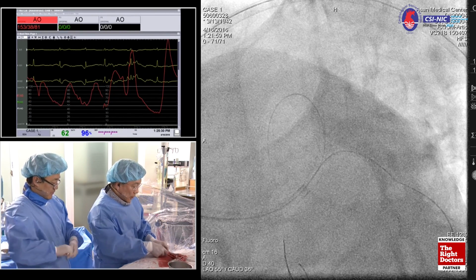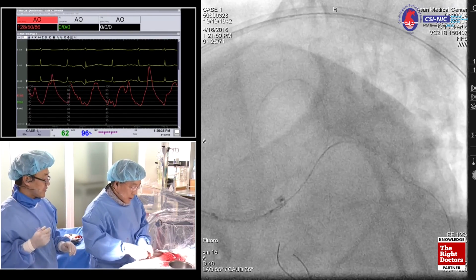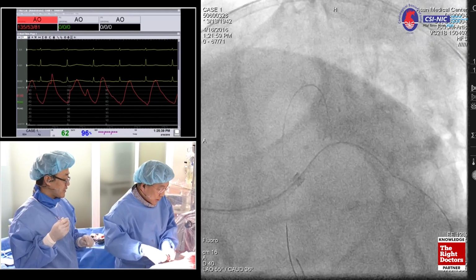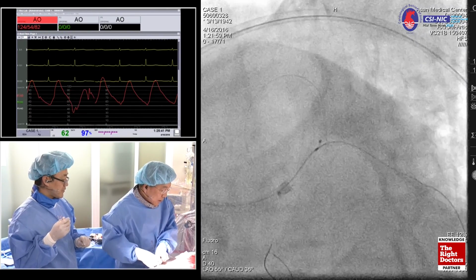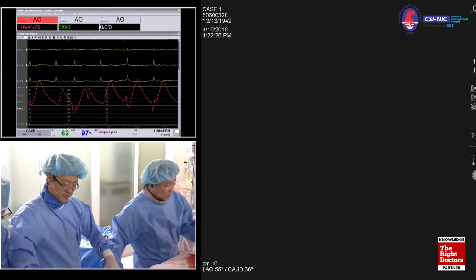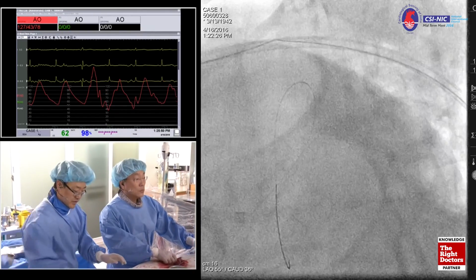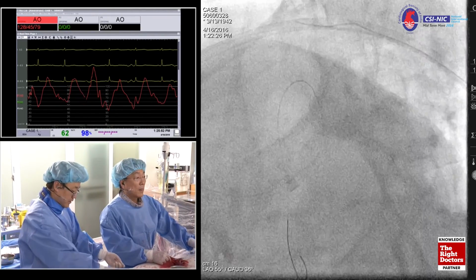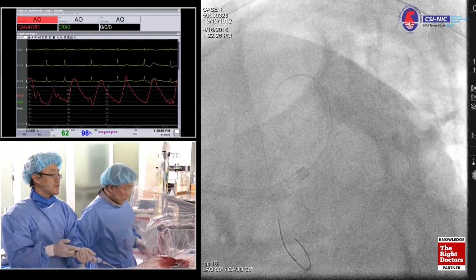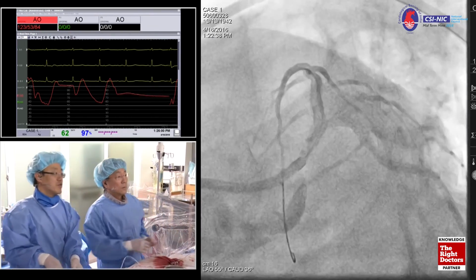What I did is kind of a TAP technique. And then, okay, for the LAD, for the DB treatment, we're going to do side branch wiring. This wire is gone. Recross it. Okay, why not? We're going to do, and you're ready. Angio force. Shoot. Okay, good.